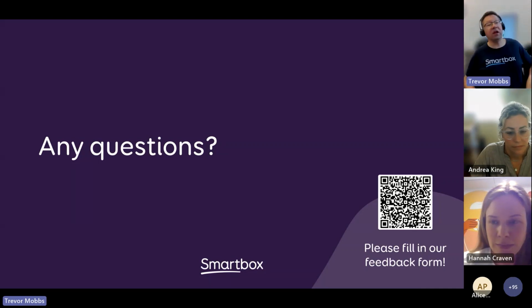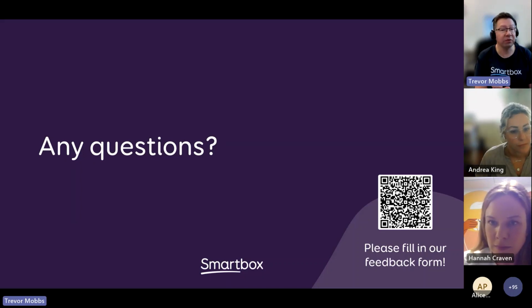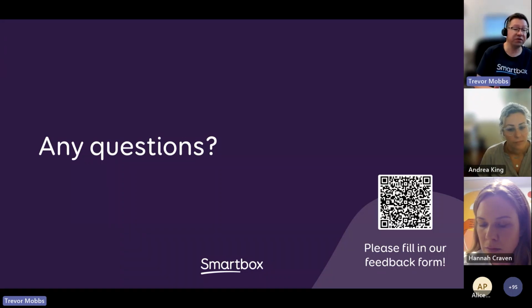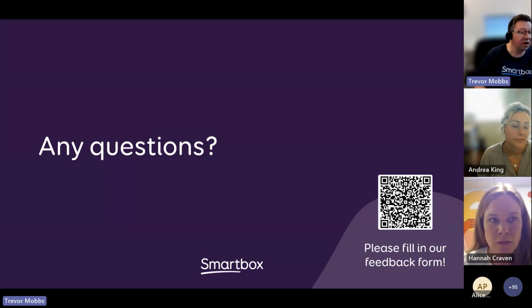Yes. So within LookLab, the activation is always by dwelling. We don't have the option built in to use blink to click or switch to click. Those are options that are available within our Grid 3 software. And we do have interactive learning grids within Grid 3 that come with the software that would probably be useful for learning those alternative access methods. So it might be a progression thing where you would start off in LookLab and build towards those interactive learning grids within Grid 3.